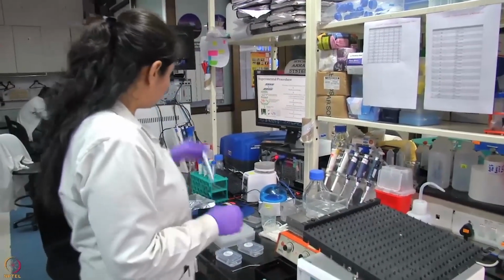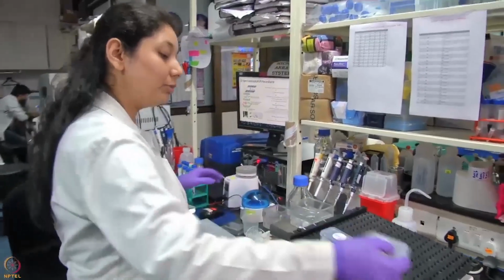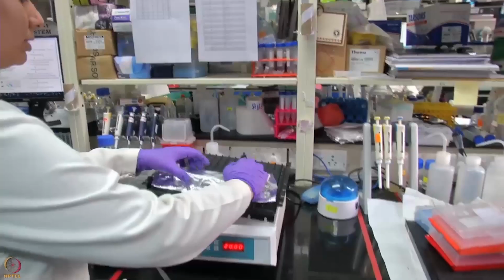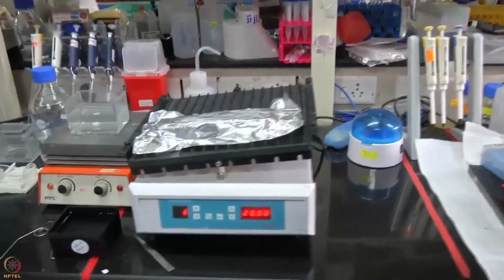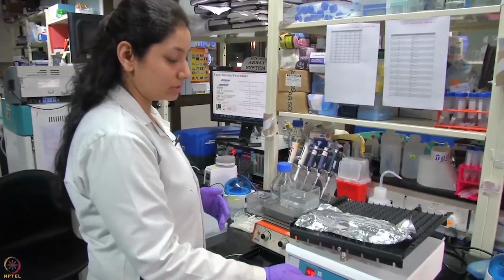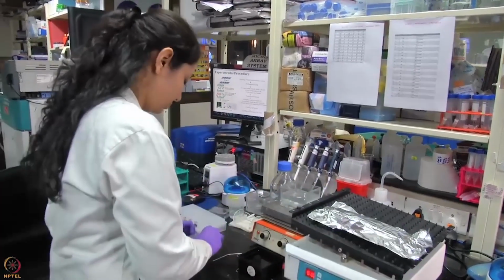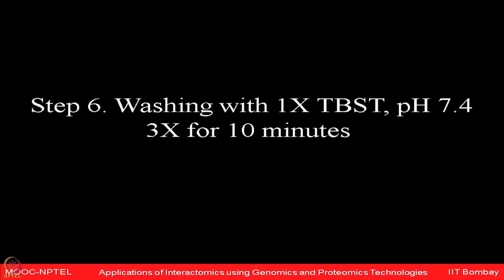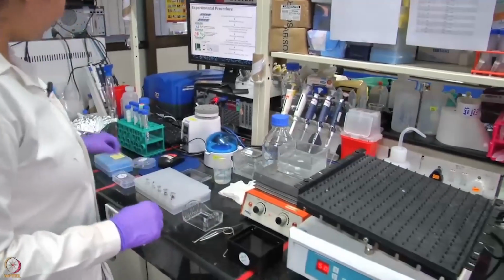And then, since this is a light sensitive reaction, make sure that the slides are covered with aluminum foil or with some black box, so that the light doesn't interfere with the reaction. So then we will start the incubation for 2 hours in dark. After 2 hours, we will stop the reaction. We will do the same procedure, but then everything will be performed in dark. Once the slide is dried, we go ahead for the scanning of the slides.